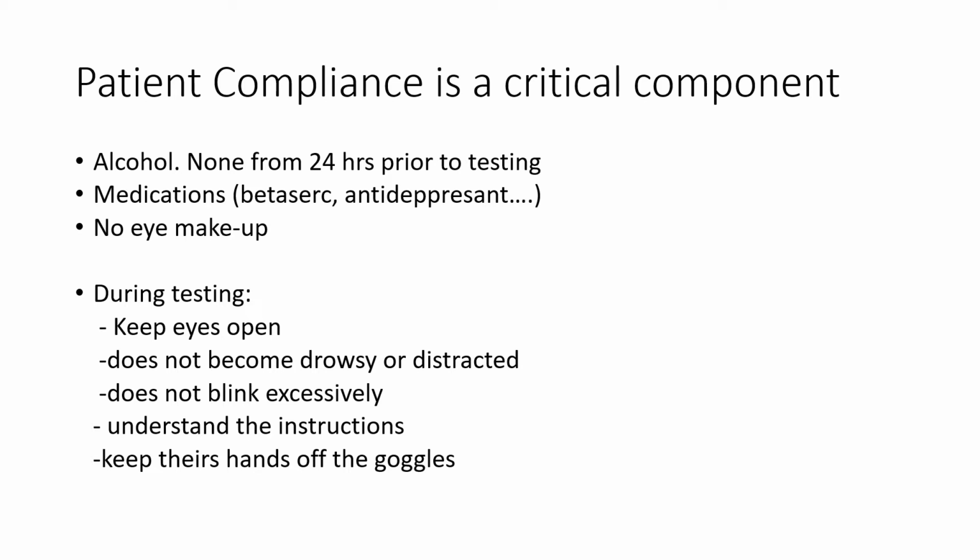And during the testing, we must ask the patient to keep eyes open and avoid becoming drowsy and distracted by other sounds or other distractions. And also we ask them to avoid blinking the eyes excessively, and we will keep on asking whether they understand the instructions, and they will be asked to keep their hands off the goggles.